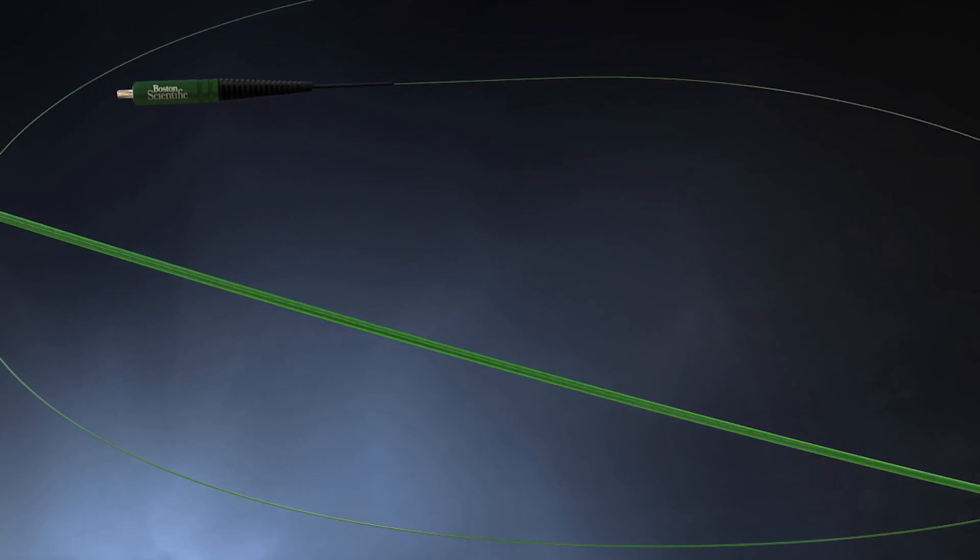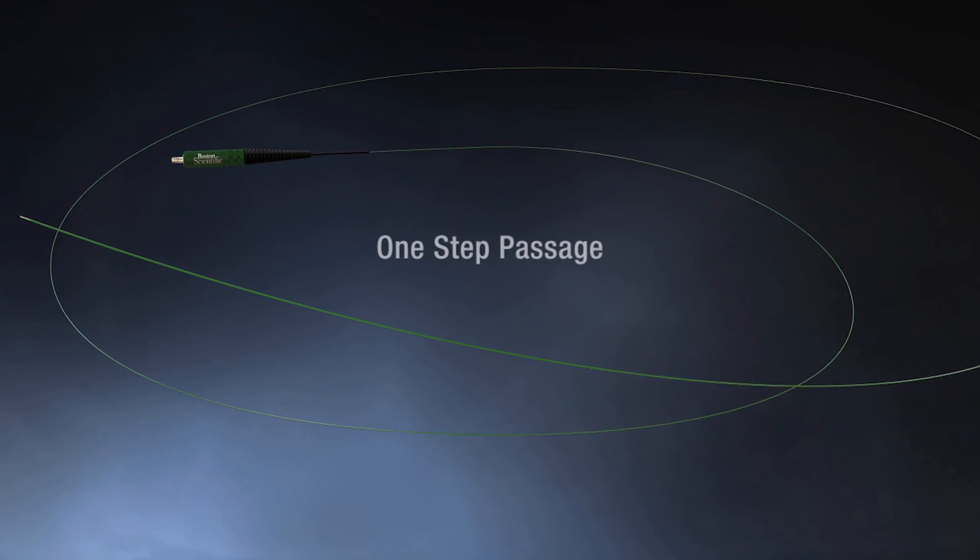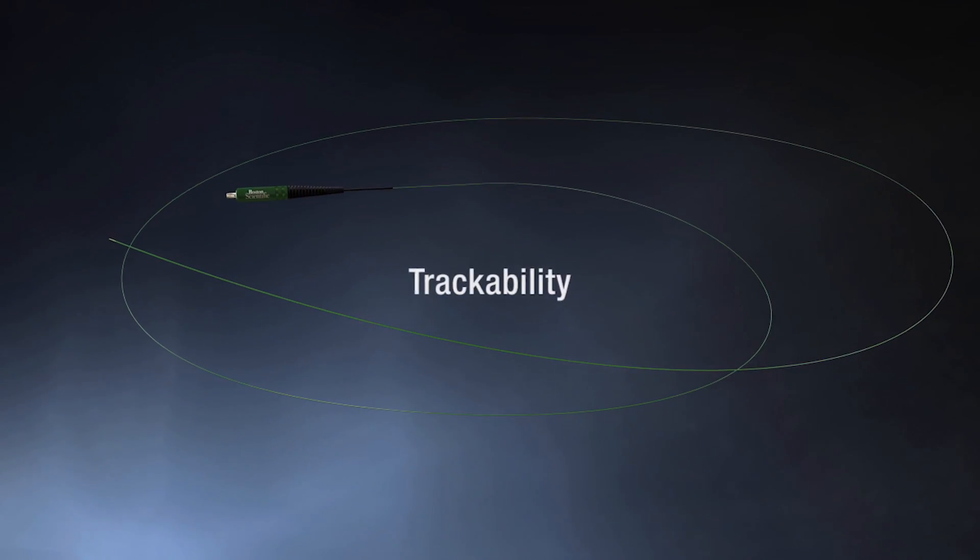AccuTrack Laser Fibers and Flexiva Track Tip Laser Fibers — one-step passage for flexible ureteroscopies.